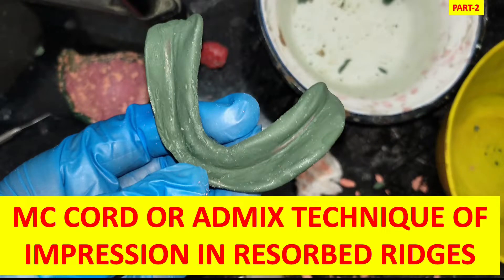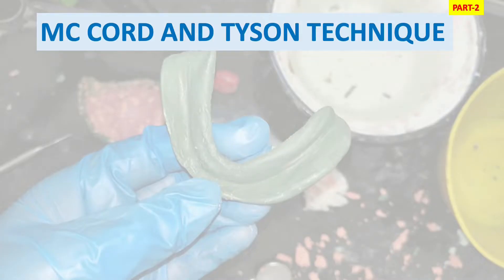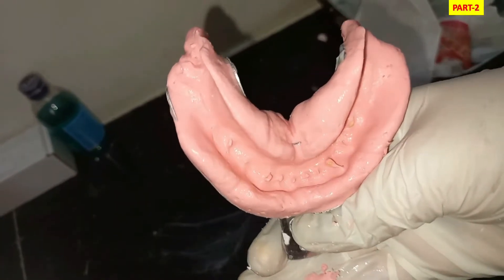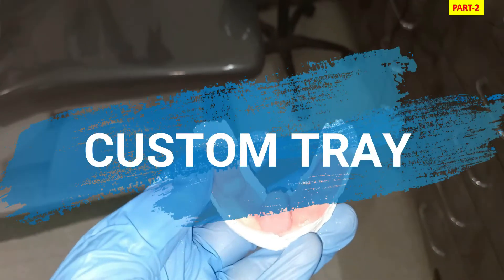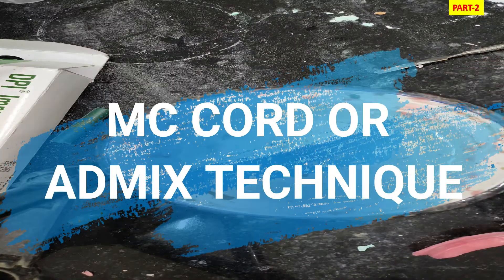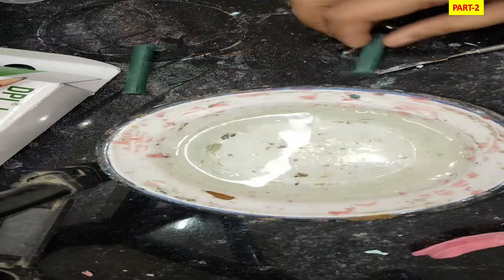Welcome back to Dental Cafe. This is Part 2 of the McCord technique, also called the admix technique, for impression in resorbed ridges — a continuation of Part 1 which was already discussed. The McCord technique was given by McCord and Dyson and involves the use of a viscous admix of impression compound and green stick compound. The first three steps were covered in Part 1.